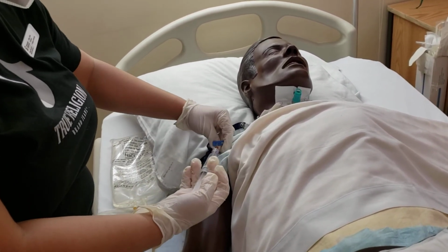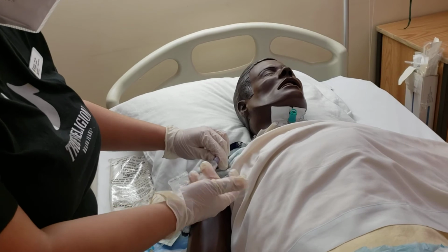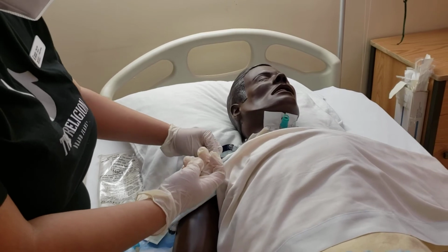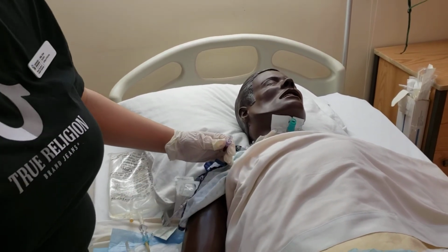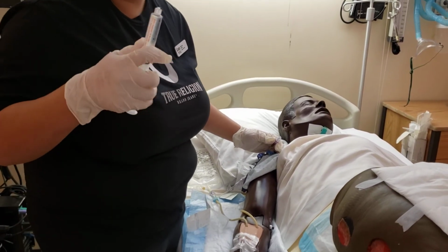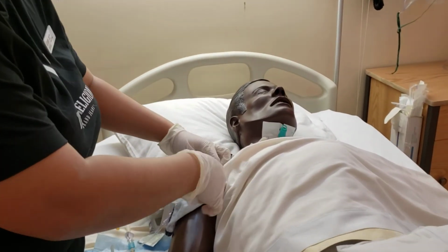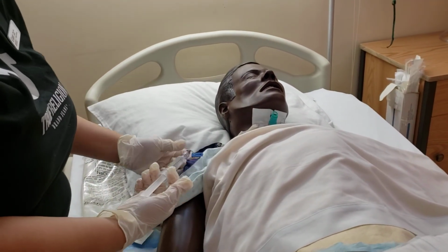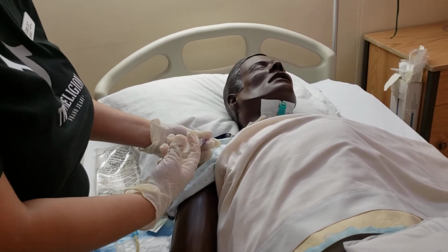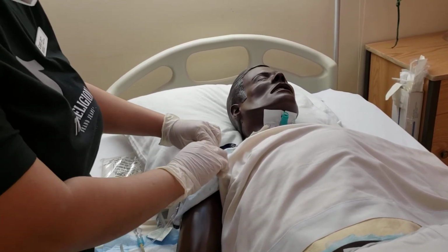Oh, it's clamped. That's why I'm meeting resistance. So we would instill using the push pause method. I would clamp and then remove, and then flush again with another one. Get rid of the air bubble. And then unclamp, and then instill the normal saline using the push pause method. I will clamp my line again and remove this.